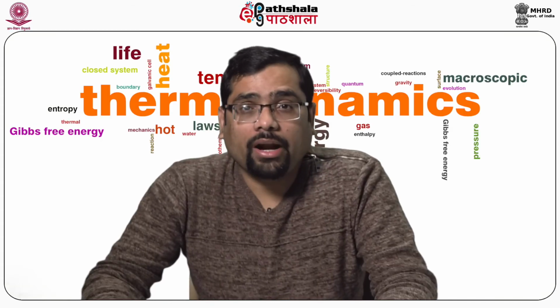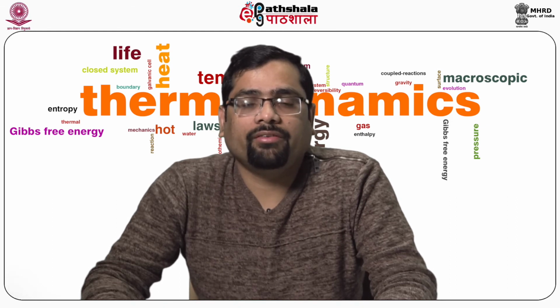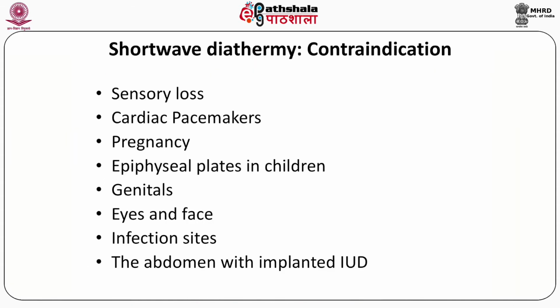There are some more contraindications adding to the previous list that I have talked about. Sensory loss. If the patient is suffering from sensory loss, we should not use the shortwave diathermy. We have talked about the metal implants. If the patient has any metal implants, the shortwave diathermy is contraindicated. Also, cardiac pacemakers are being used by some patients, the artificial pacemakers. In those patients also, we should not use the shortwave diathermy.